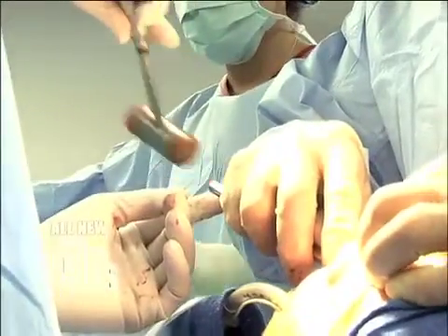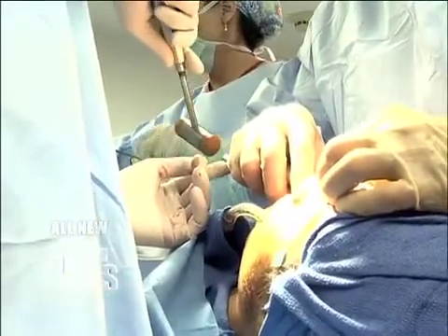And here, everyone sees this — we're breaking the bone. We had a few squeamish faces. Including mine.